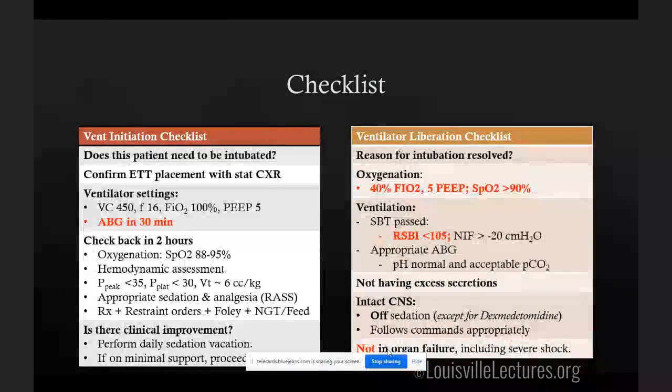So one thing I wanted to impart to you guys, it's really an excellent opening lecture from Dr. Chan, is to think about where you might encounter this not only in the hospital, but also in your board exam. Every MedApp or UWorld question I have, and Nadine, we will get that out to you. Anytime you get a board question on this, they are probably going to give you the current vent settings, and they're either going to tell you the patient is not oxygenating well or that the vent is alarming. They want you to recognize that the patient's tidal volume is appropriate for their ideal body weight. If they're alarming, it's usually that it's not appropriate or that there is some mechanical issue.